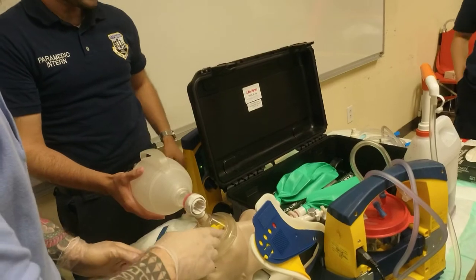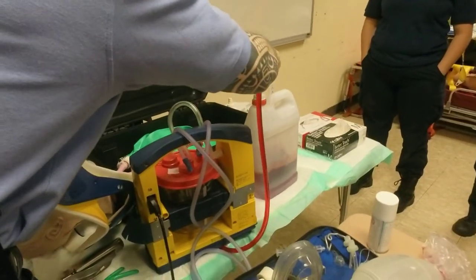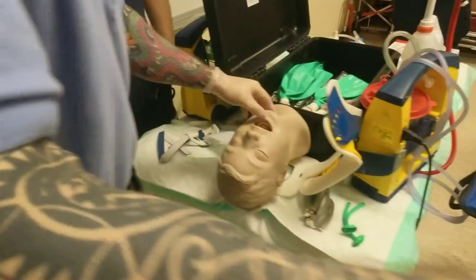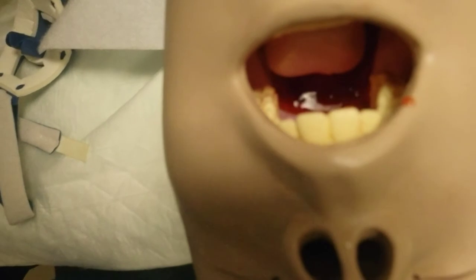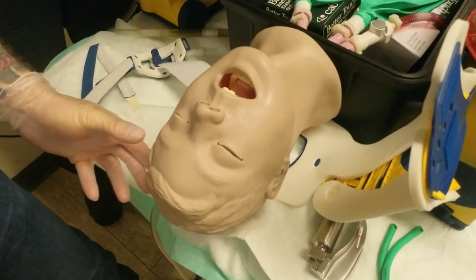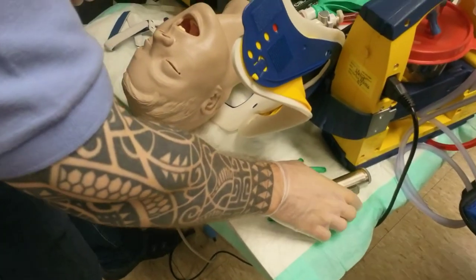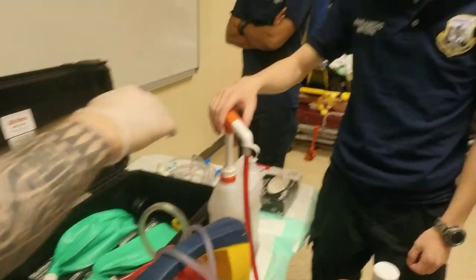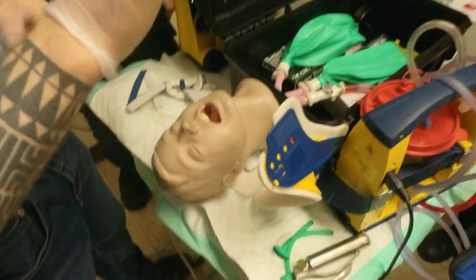Now imagine we have a different situation — a patient with a contaminated airway. See the blood in the airway? As you're suctioning, it keeps coming out. We already connected a DeCant catheter to one suction unit. Let me connect another one. The second catheter will have the suction port covered so it doesn't stop suctioning. We're going to lead with the laryngoscope — do cross-finger technique, and I start suctioning.